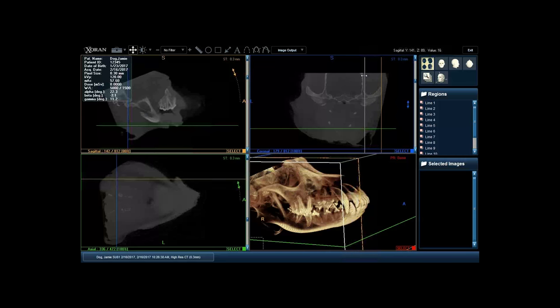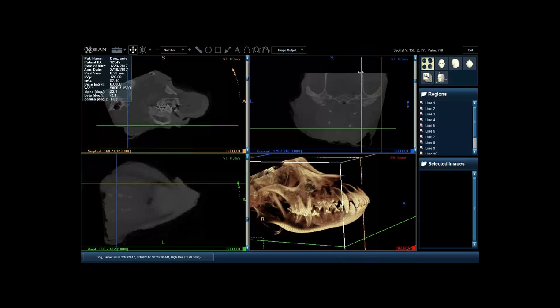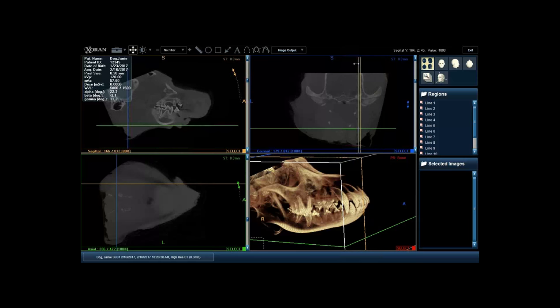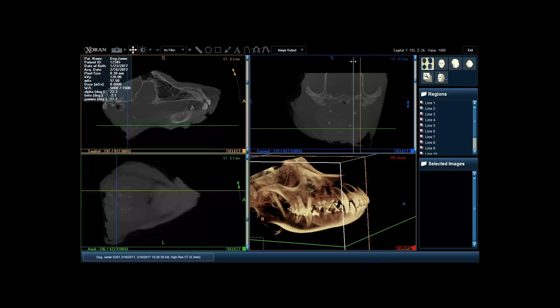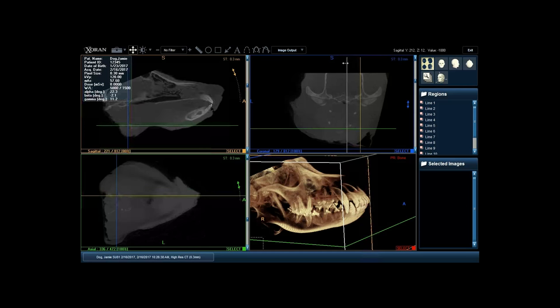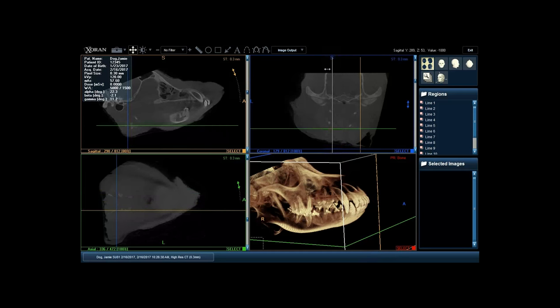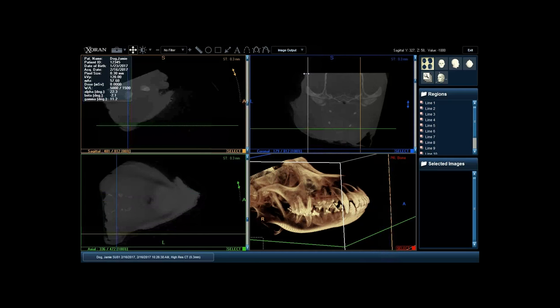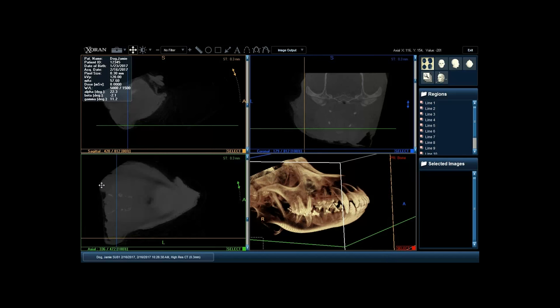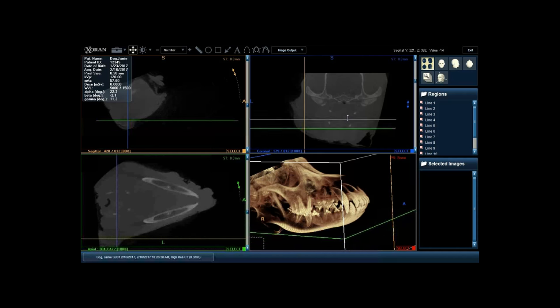Once I've gone through the transverse view, I move to my sagittal view. I start on one side — the right side of the patient — and scroll through. You can identify all the structures from this angle, see the dilaceration of roots at the mandibular second molar, and identify the apex of each tooth. Then I always go back through and look at my axial view last — not that it doesn't give important information, but I find the transverse and sagittal views more immediately helpful.